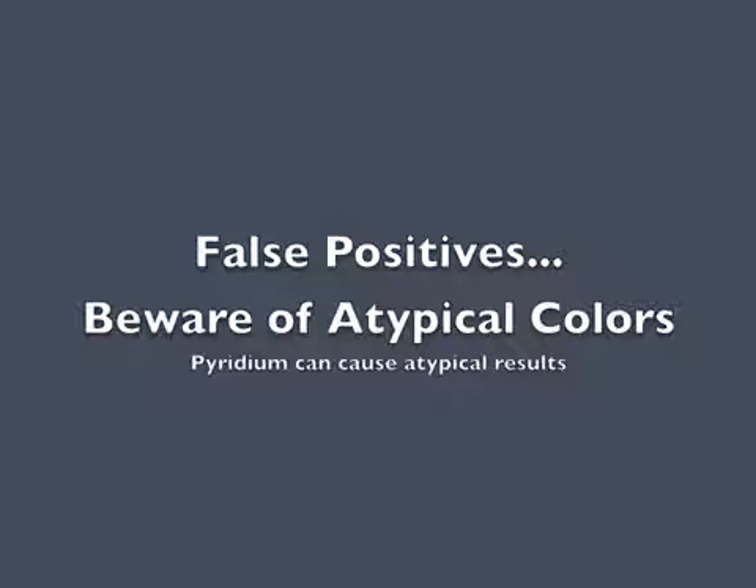Sometimes Pyridium, an over-the-counter medication, can cause the urine to be an orange pigment and will cause the Ictotest to appear as a sort of fuchsia positive reaction. This is actually a negative reaction for bilirubin and should be reported as negative.